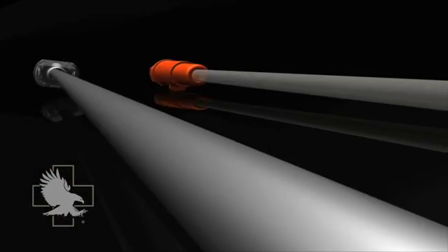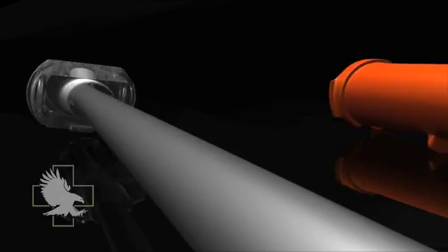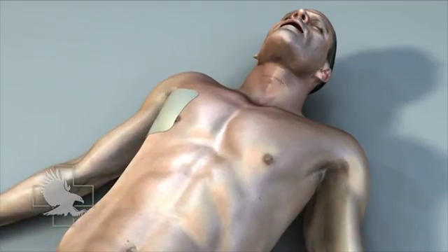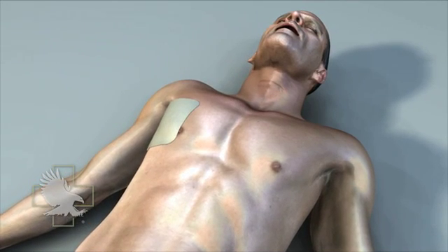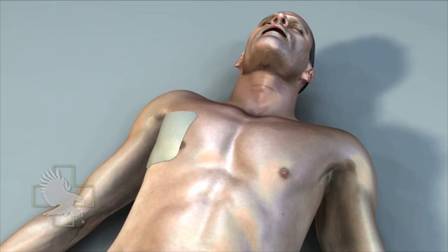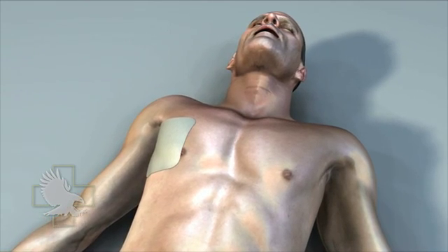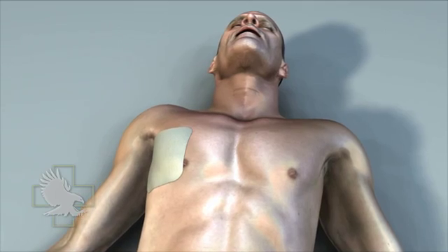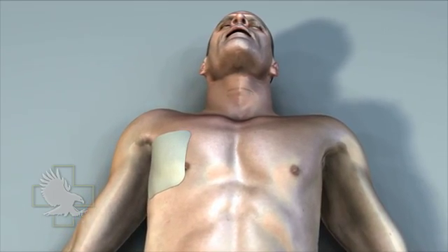The ARS Needle Decompression Kit is intended for use in the management of casualties who present with signs and symptoms of a tension pneumothorax. Research data from the U.S. Army Institute of Surgical Research has shown that chest decompression with a 14-gauge needle is as successful as a chest tube in relieving a tension pneumothorax, and that the therapeutic benefit persists for at least four hours.